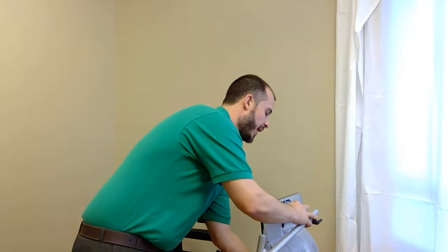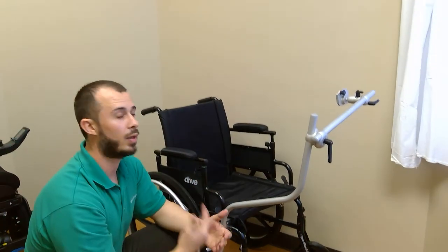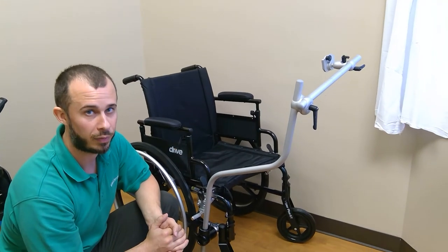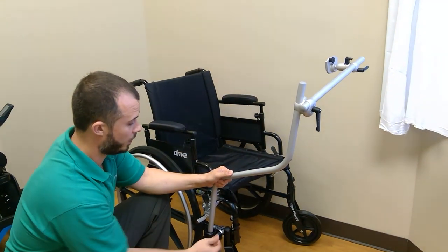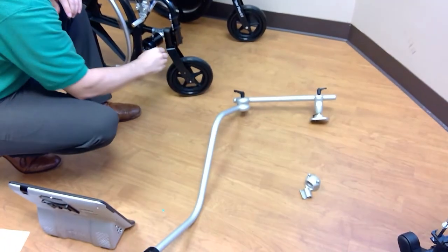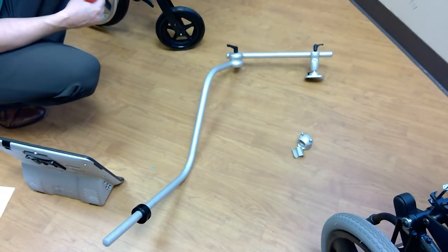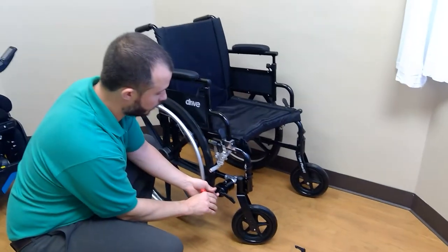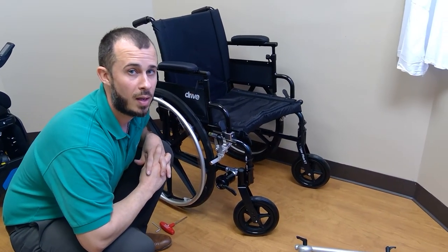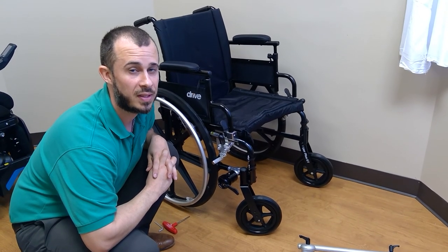The last step is to take the whole mount off and do a quality check — make sure all bolts are nice and tight and nothing was missed or forgotten before the user has the chair. To remove, loosen the black lever and this entire piece lifts off and away, making it very easy to get the chair into a car, van, or bus for transport. Come back through, tighten everything up, check all the joints, and you should be good to go. If you have any questions, feel free to contact us at 1-800-344-1778. Thanks.